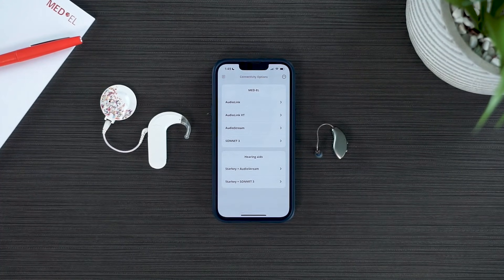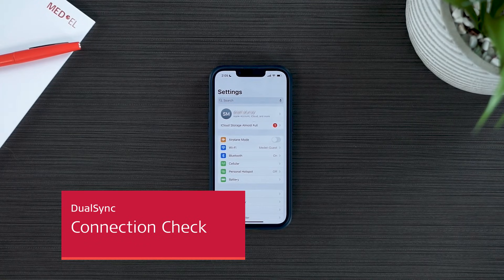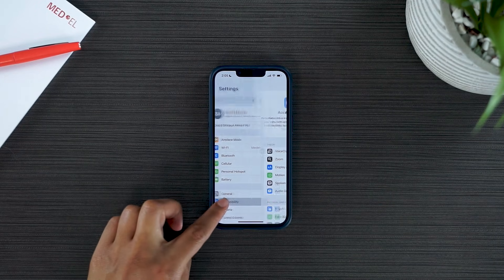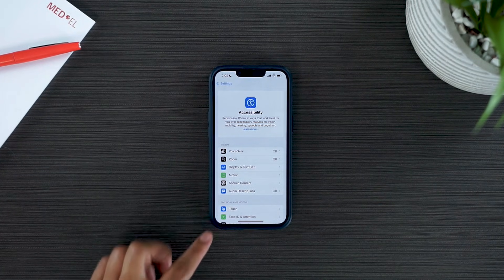You are now able to enjoy your bimodal streaming. With both devices connected in your Hearing Devices menu, you don't need to use the Audio Key app to enjoy streaming. To ensure your devices are both connected and ready to stream, head back to Settings, select Accessibility, and then select Hearing Devices.